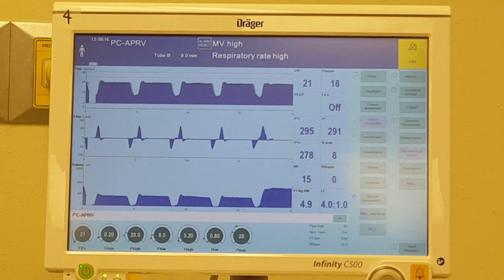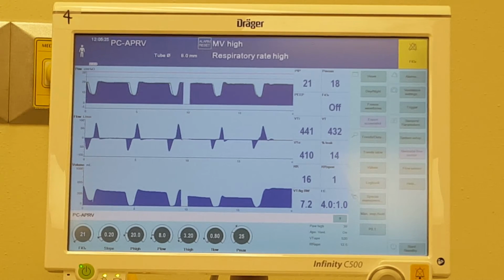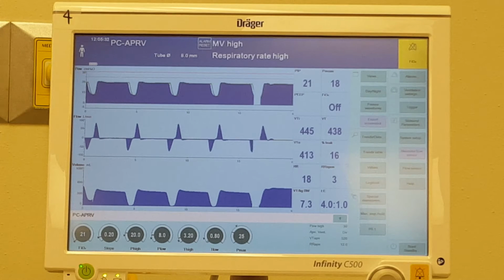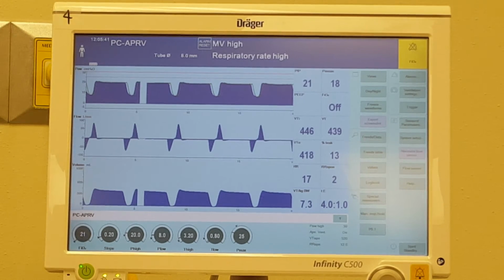And we can see on the first breath after increased compliance, we can see our pressures are still obviously 21. We're getting the overshoot of 1 above our P high. But our mean should fall off. The mean will not change, sorry. I was thinking ahead to changing, if we change the IE ratio based on improved compliance, then that would change. But what has changed? Our tidal volume.